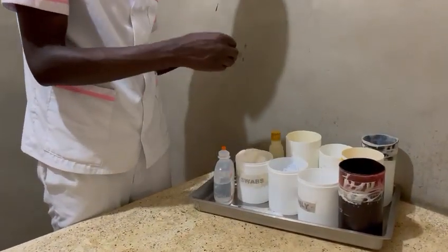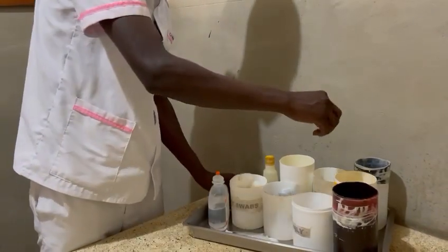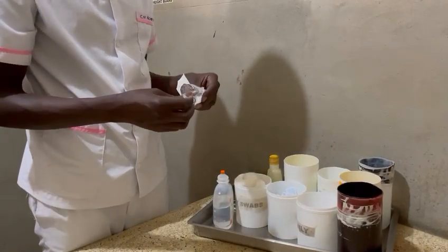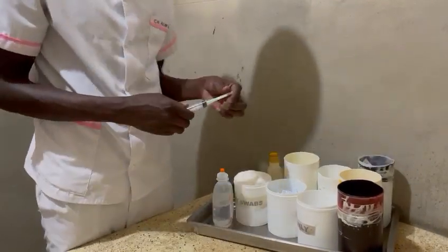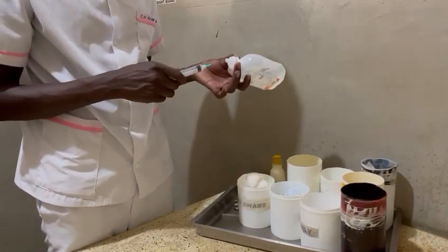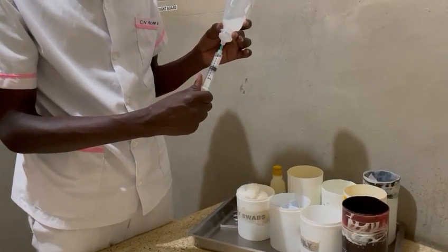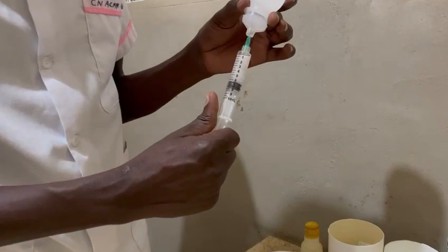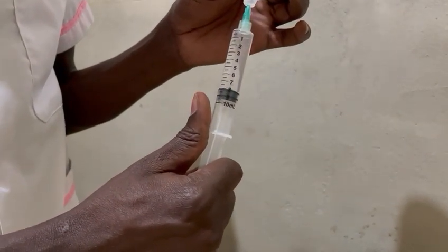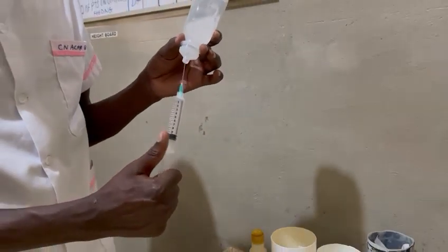So let's do it practically. I open this and then I break my drug. I start by aspirating nine mils of dextrose five percent — nine mils.